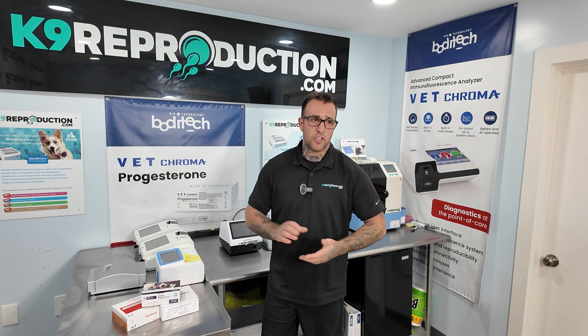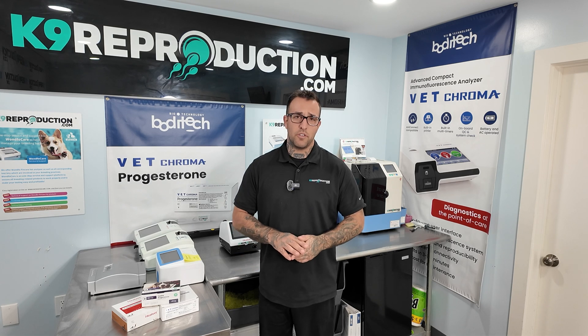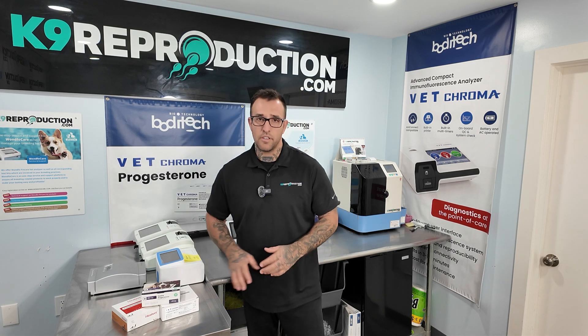Functionally, Heel Vet, Wanfo, and Vet Chroma are all very good at the jobs they're doing in canine progesterone, and I would highly recommend any of these three, honestly.